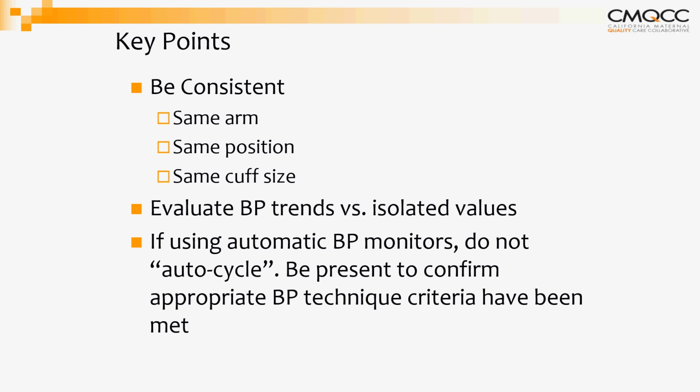So it's important that if you do use auto cycle, and you have to, that either you're present to ensure that the cuff is correctly placed, or that if it's taken off, that you reapply it and don't just leave it to cycle and expect that you're going to get accurate recordings. Next slide, please.